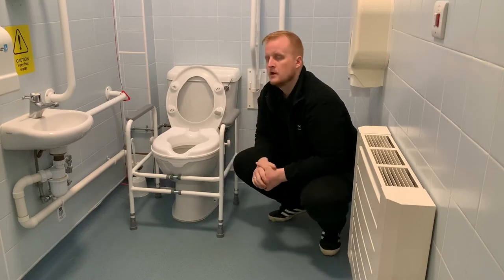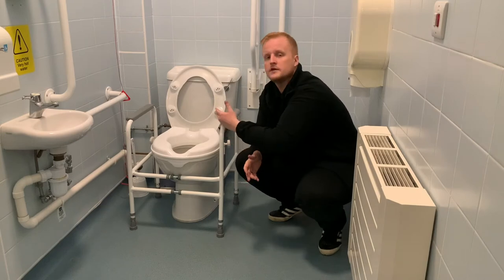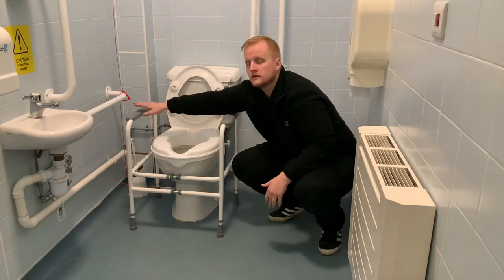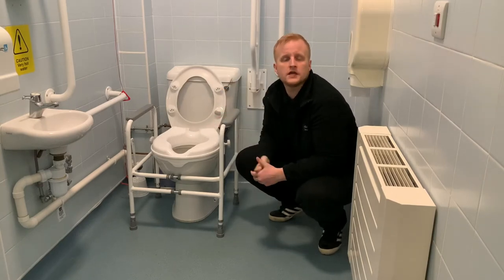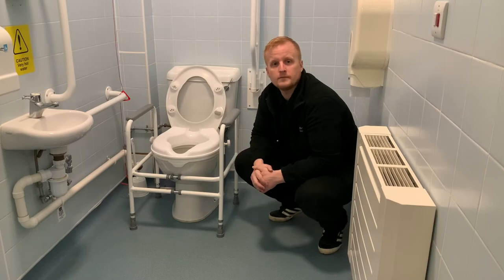What this is for is it supports customers yourselves in doing safe and independent toilet transfers — getting on and off using your armrests. What we would always advocate is to use these armrests instead of pulling yourself up using a grab rail, for example, or certainly don't use your own sink or basin, which a lot of people tend to do.